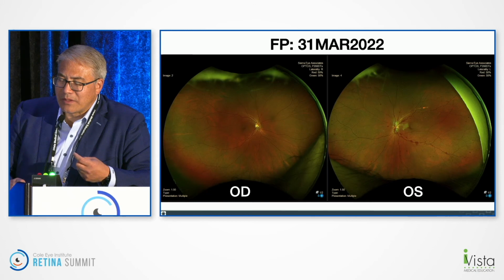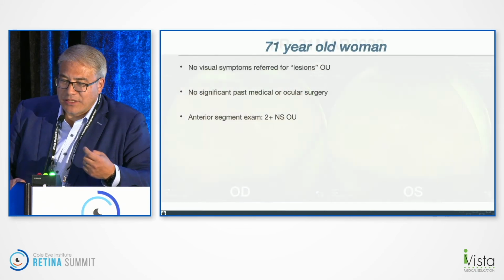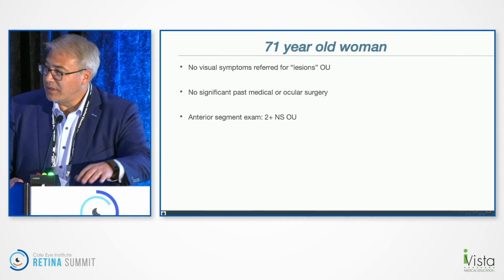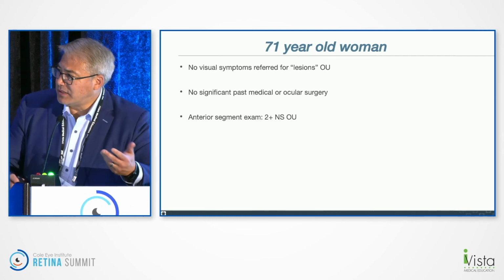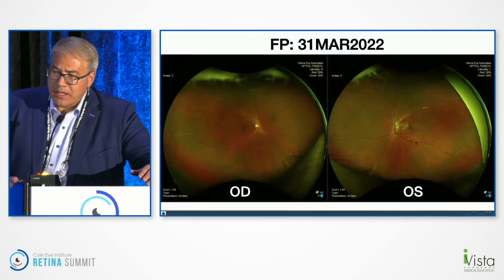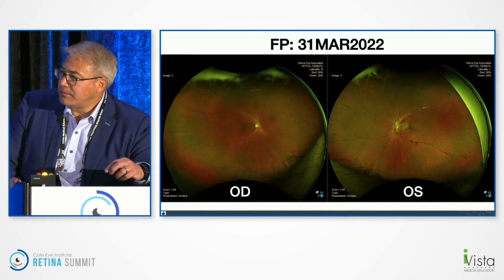Hamartoma? Nope. How about just a BRAO? The occlusion. Yeah, so this is a BRAO secondary to COVID vaccine. So we're starting to see some. It's a lot of hemorrhage for a BRAO. Yeah, it's more than a BRAO. Maybe a vein occlusion or retinal artery occlusion.